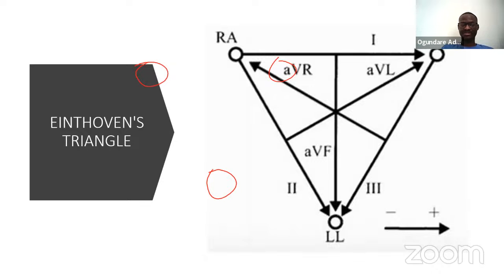So with the 5 cable ECG, they have another one for the right leg and one for the chest electrodes. The chest electrode can be anywhere from V1 to V6. And if you are doing intraoperative monitoring and your patient is having thoracic surgery, it can be put posteriorly as well.